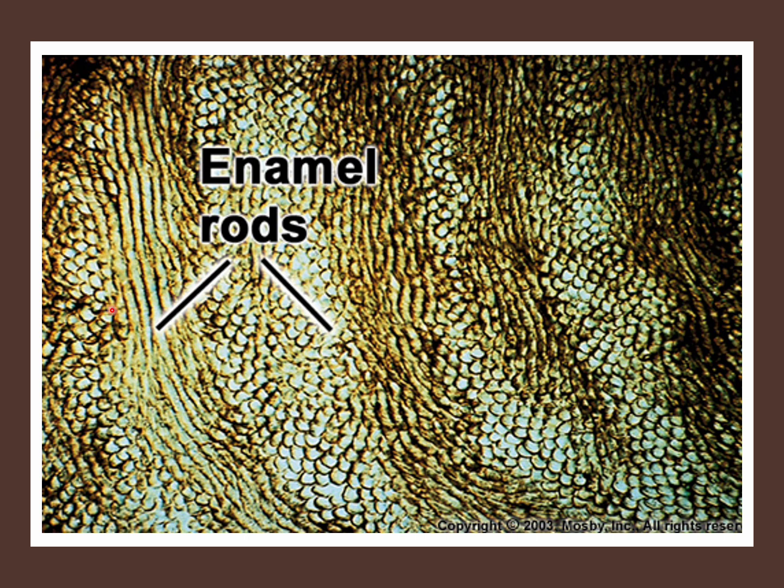If the enamel rods are cut longitudinally, you can see them as long passages like this. These are longitudinally cut enamel rods. Imagine that you have a spaghetti, one spaghetti in your hand, and you cut it in half. That's what you are gonna see. It's like a long passage. But if it's cut in cross section, you're gonna see the keyhole pattern, the circular, or the other two patterns we have discussed.